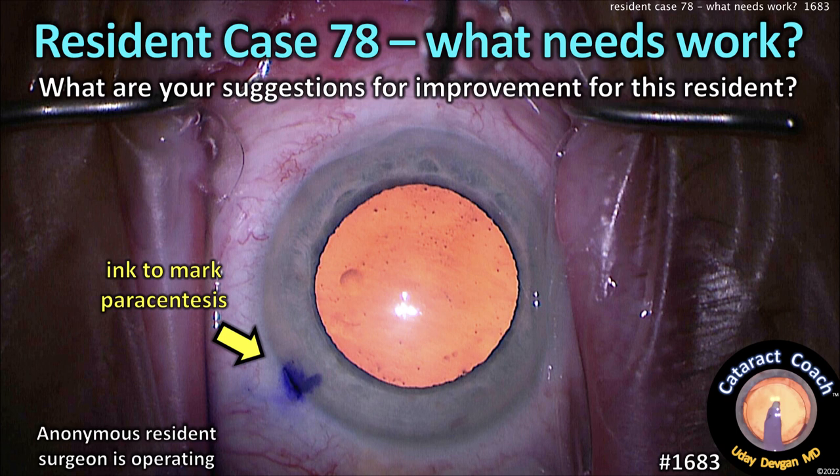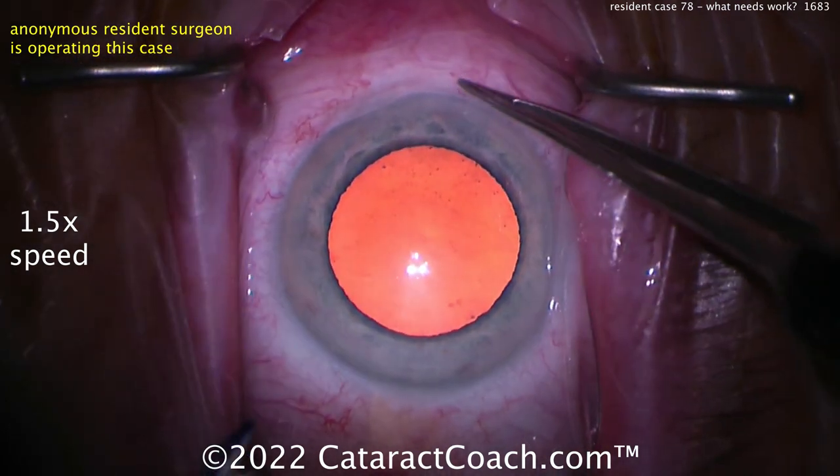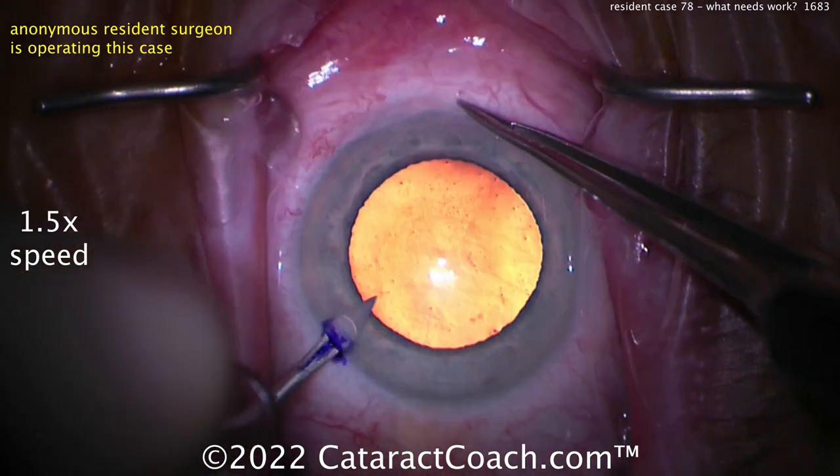Cataractcoach.com resident case 78: what needs work, what are your suggestions for improvement for this resident? Let's watch the case — unedited, start to finish. I'm showing it at one and a half speed, so even then it's pretty remarkable for case number 78.